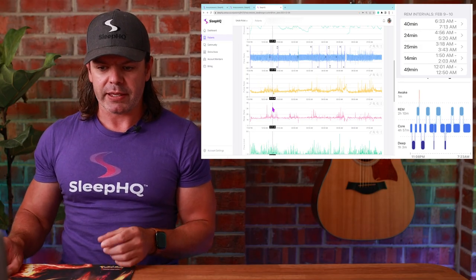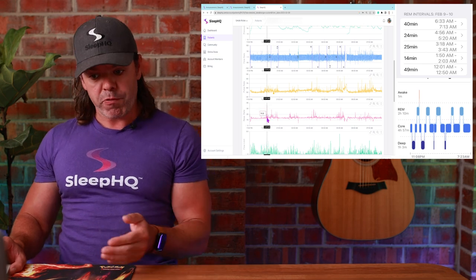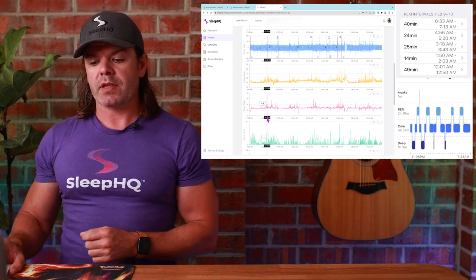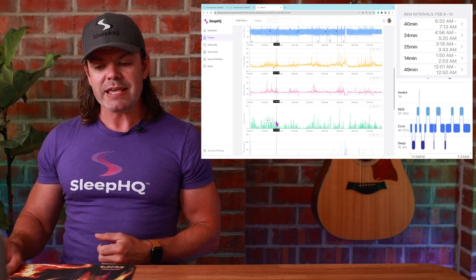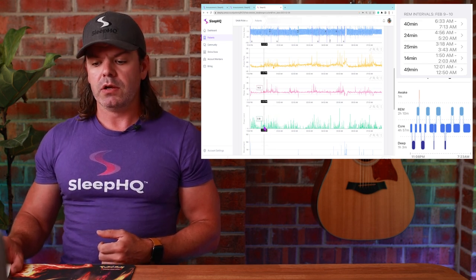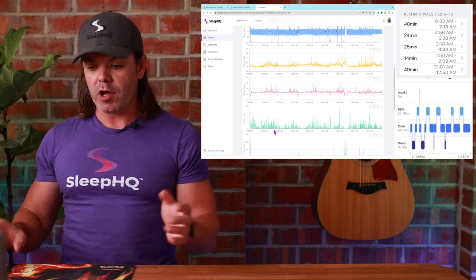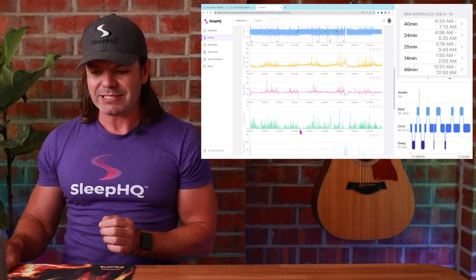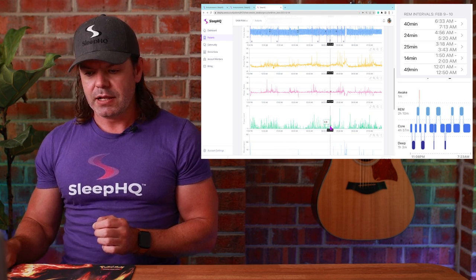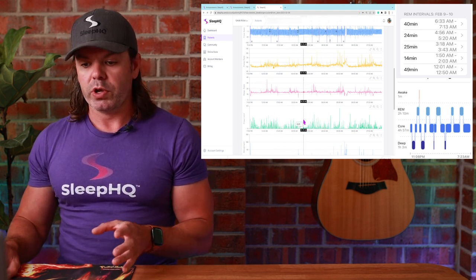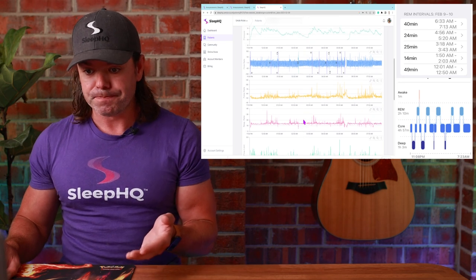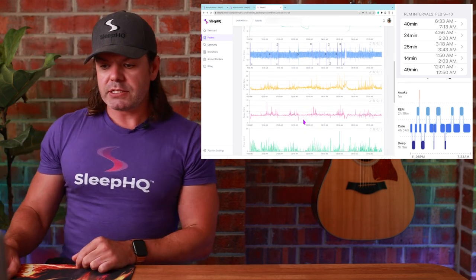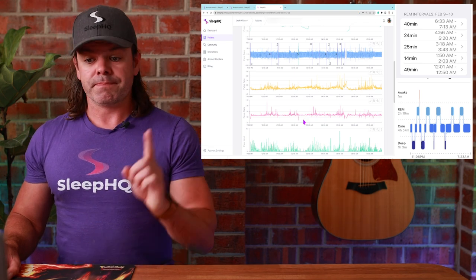The breathing is also becoming erratic. And then also there, you can see, there's like this cluster. He's got quite a lot of flow limitation throughout the night, but you can certainly see some clusters, can't you? In green here, there's a cluster here, cluster here, associated with the REM period. So that's number one.